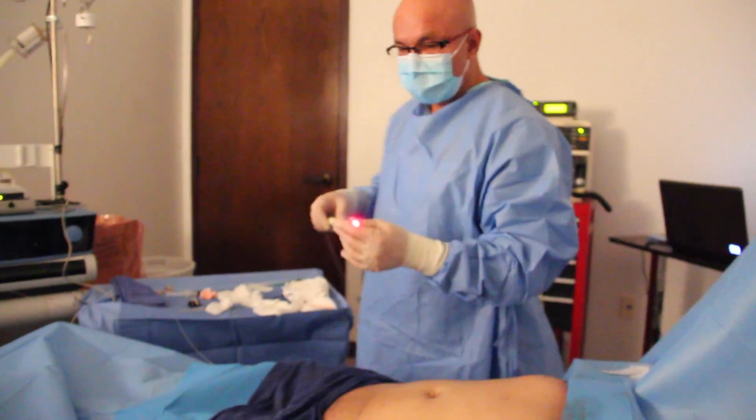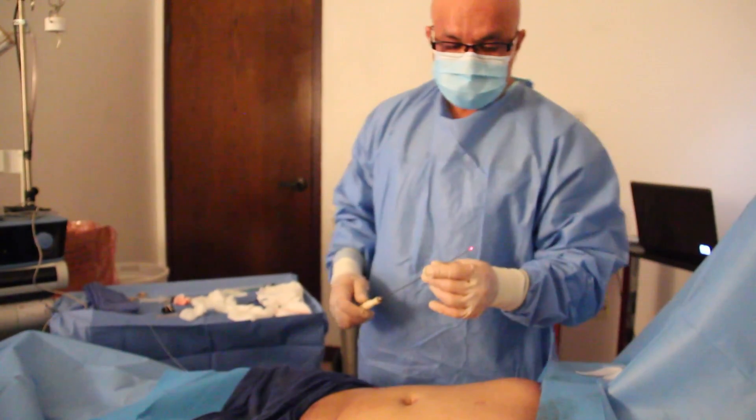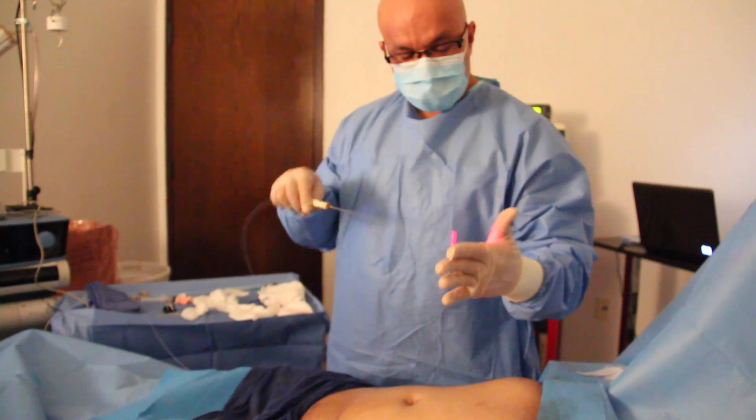I finished with ultrasound and collected some of the fat.